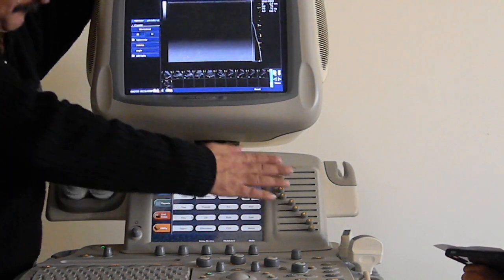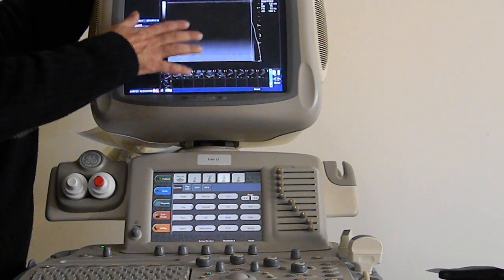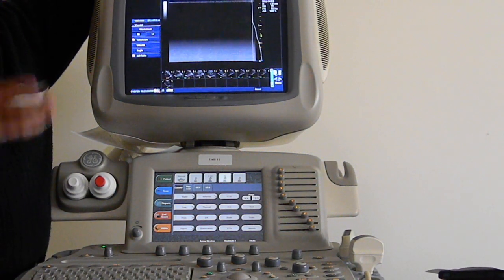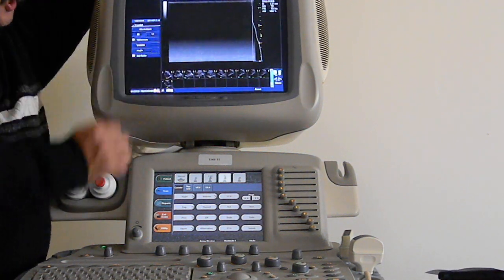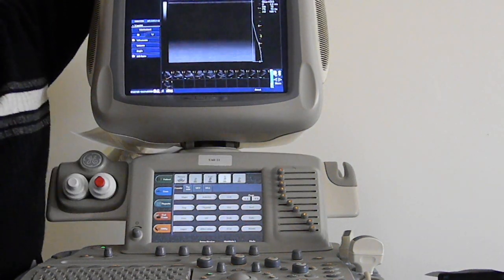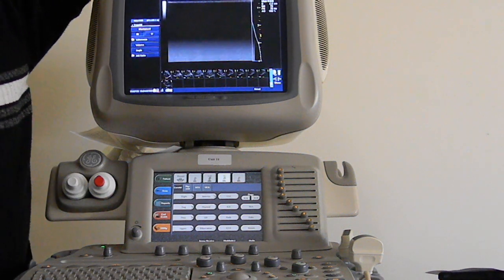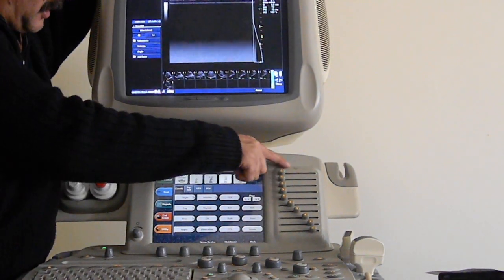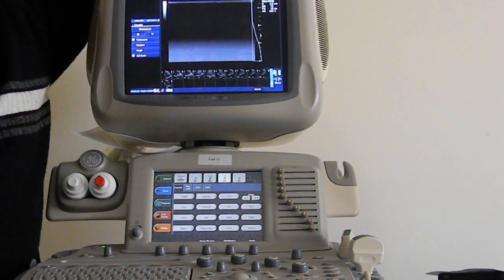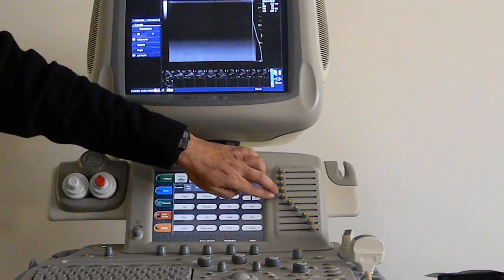So all dependent upon the amount of tissue, or those kinds of tissue, and how much attenuation the sound wave undergoes as it travels through those tissues will determine the depth at which you may start to compensate. This is your curve of the TGC, or the anatomy of the TGC curve. But right now, just remember, this is the minimum.